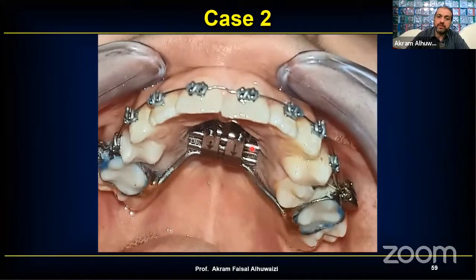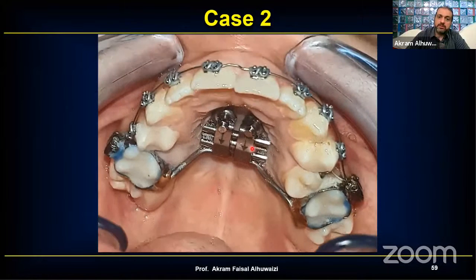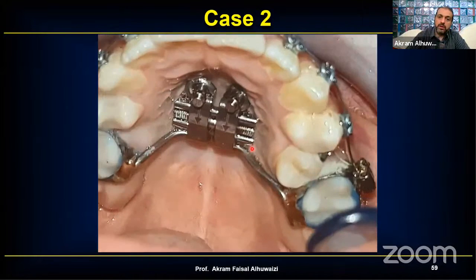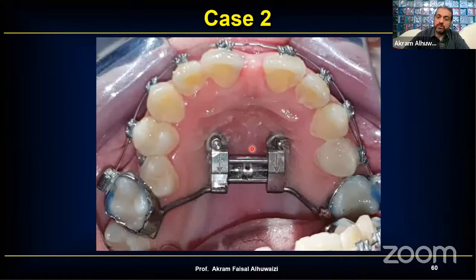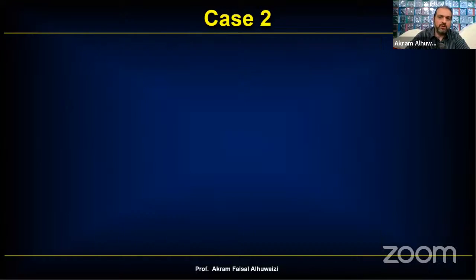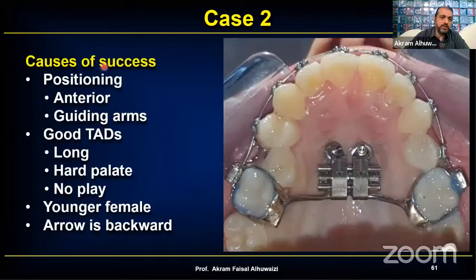And this is the patient there. And we start opening the screw. And after opening the screw, the suture opens. And that was a successful case. That was my first case of a 17-year-old female who actually passed. And I was so excited going through the causes of success.